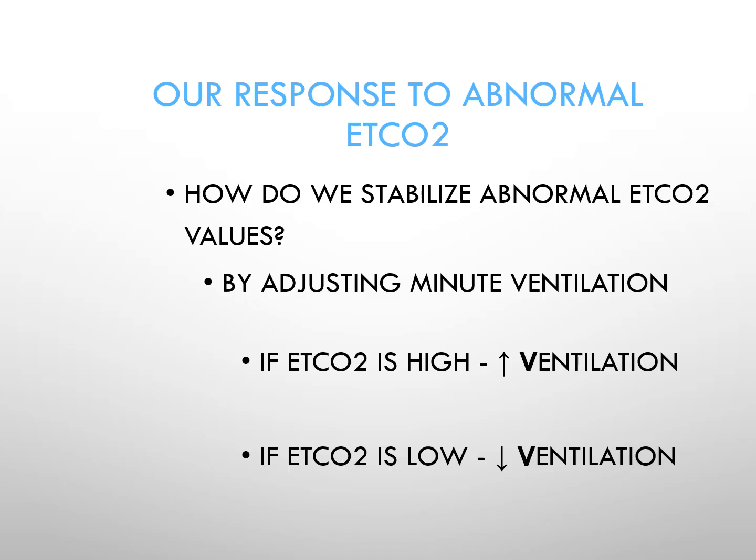Now, the opposite is also true. The opposite being, if the end-tidal CO2 is low, and let's say that it actually does correlate, which it often does, with what's actually in the arterial blood. So the patient has a respiratory alkalosis, you're going to do the opposite. You're going to decrease the ventilation.